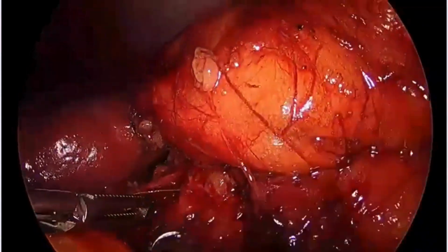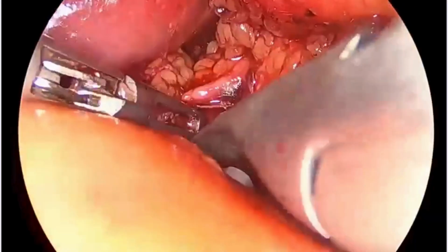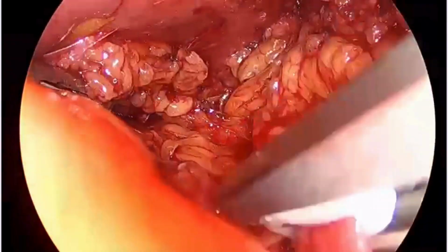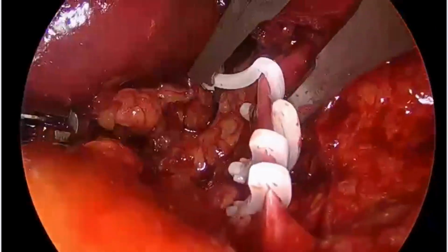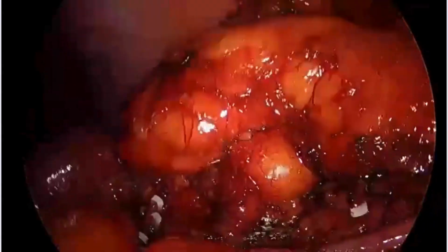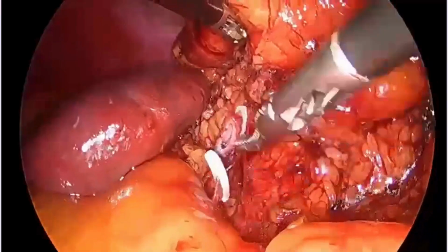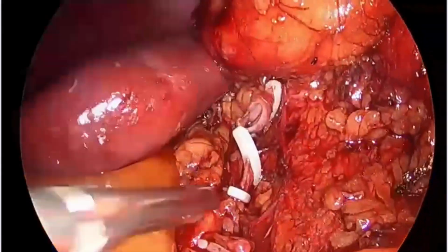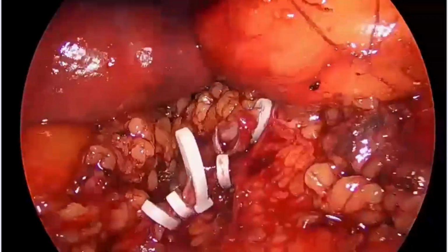And once we were a bit confident that this could be the renal artery, we tried to clip it, but because of space constraint we could not clip it properly. So what we did was we just clipped it and then left it, then clipped the renal vein so that we can get some more space, after making sure that that's the only renal artery of the patient. And once the renal vein was cut and we observed that there is no congestion of the kidney and no more bleeding from anywhere, we clipped the renal artery confidently and then divided it.